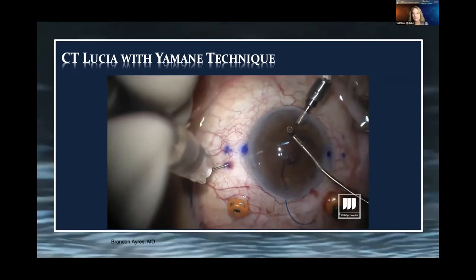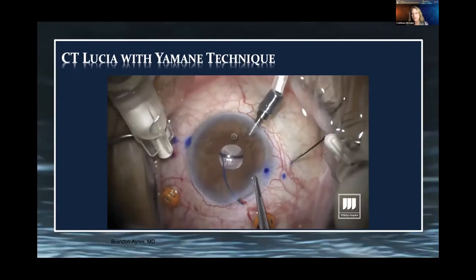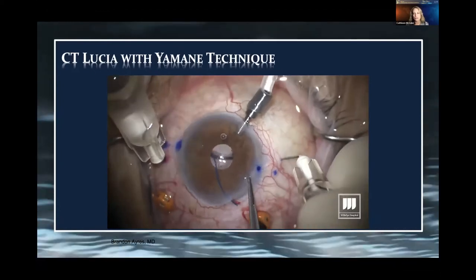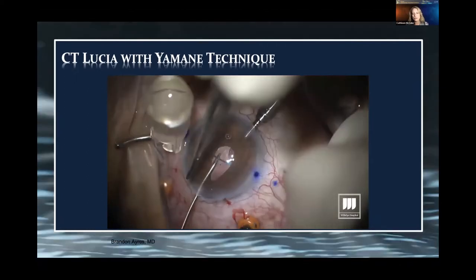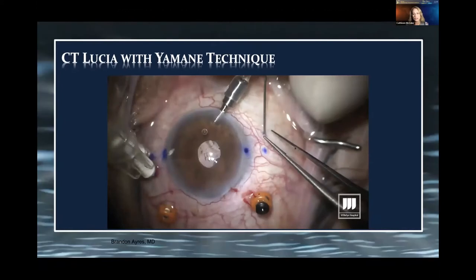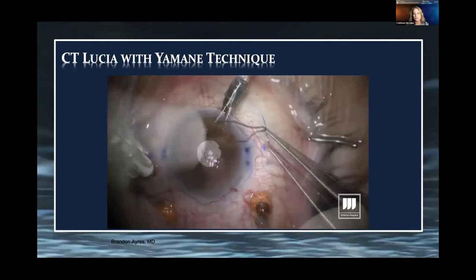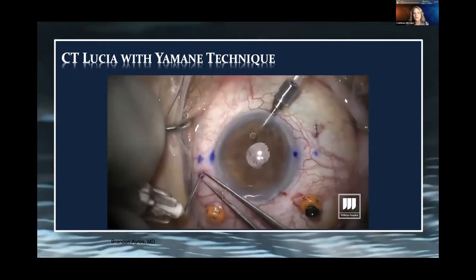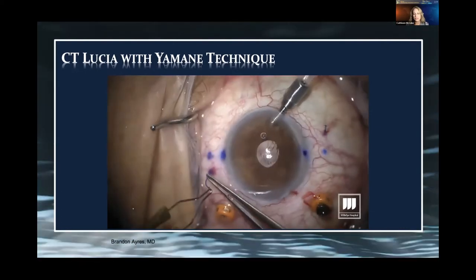Repeating the same thing for the trailing haptic, remembering the orientation — you want to be clockwise of those 2-millimeter marks to initiate the tunnel. Once you visualize the bevel of the needle in the pupil, introduce the trailing haptic and externalize them, creating flanges with low-temperature cautery that will be buried into sclera. One key tip: don't make the flange too large. You want to make sure it's fully buried into superficial sclera — a smaller flange makes that easier to accomplish.